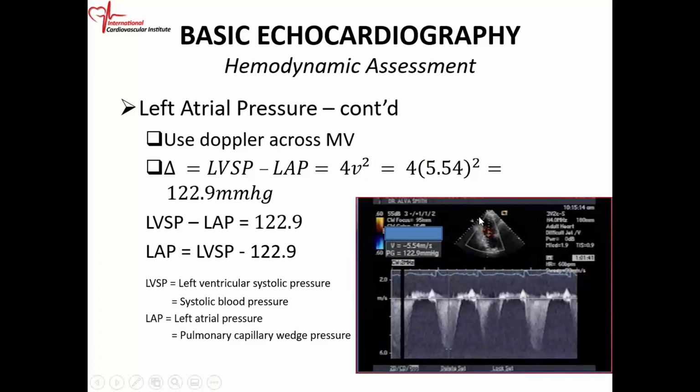The transducer is right there. With mitral regurgitation, blood is going to flow from the LV across the mitral valve into the left atrium. So it's going to move away from the transducer. Hence, it's below the baseline. So you see the envelope below the baseline. It's a CW measure because the velocity is usually about 5 meters per second. And it's a systolic flow from the onset of the QRS to the T wave.